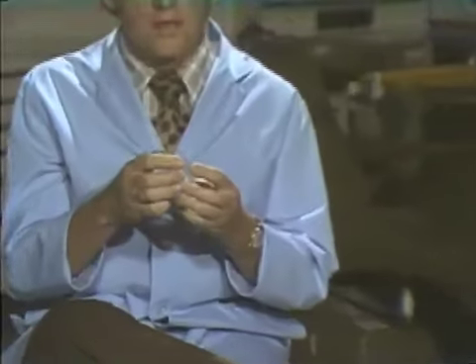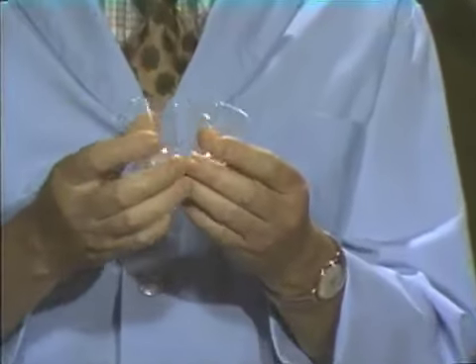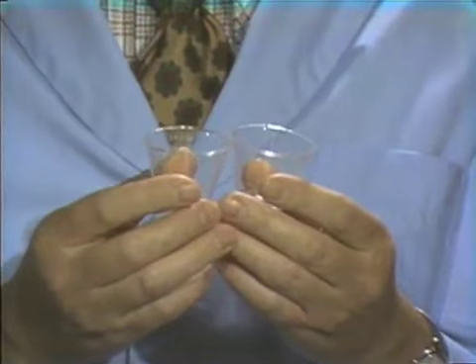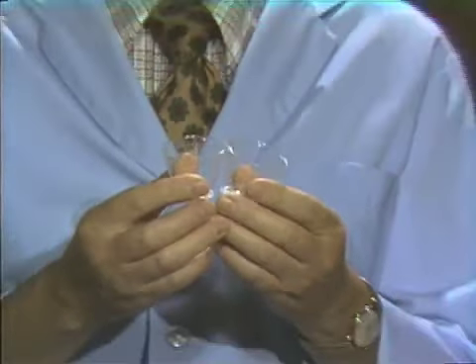However, once you get the feel of the material, you can estimate the mix of the material by putting a certain amount of the powder out on the pad and then estimating the amount of liquid you would want. From this, you would determine the stiffness or the consistency of the mix by how much powder you put in. So in this demonstration, I will show how we estimate it, and I prefer to estimate the mix.